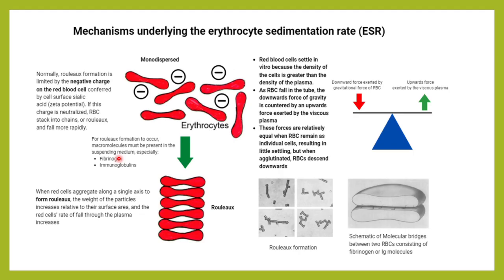So fibrinogen एक body का response है जब inflammation होता है. तो फाइब्रिनोजन जब बढ़ता है, ये आरबीसीज को भी पुल करता है, क्लॉट फॉर्मेशन करता है ये. तो दैट इज वाई ये फाइब्रिनोजन बढ़ने के वजह से आरबीसी सेटल डाउन जल्दी होते हैं.